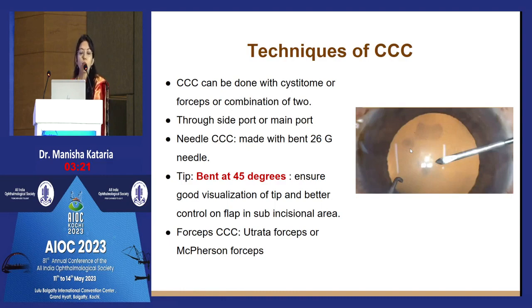The mechanical difference between the needle cystitome and forceps is that the needle cystitome works in the X and Y axis, whereas forceps works in the Z axis as well. So whenever we have to counter zonular forces, like in intumescent cataracts and pediatric cataracts, it is a good idea to do it with the forceps.